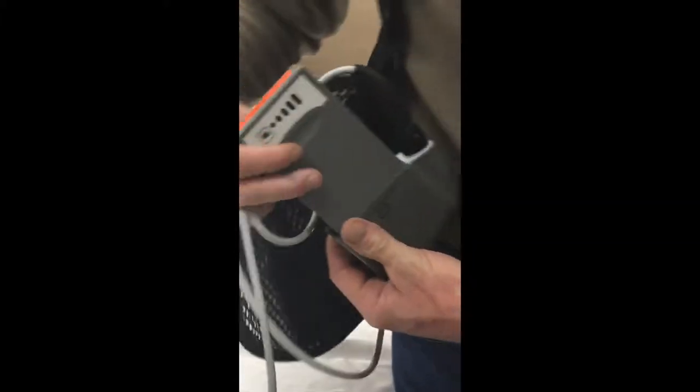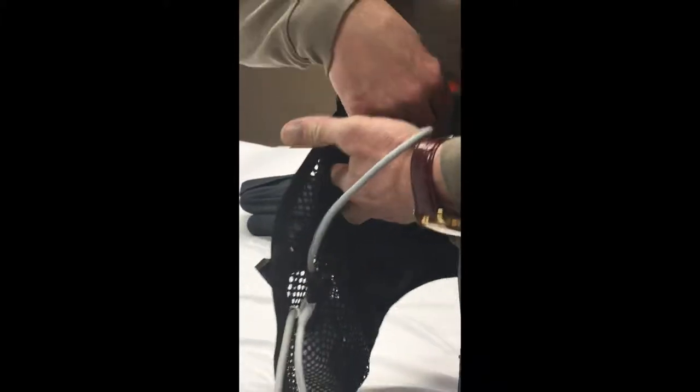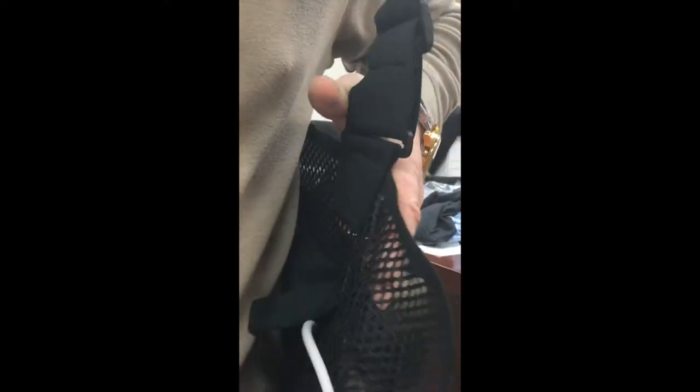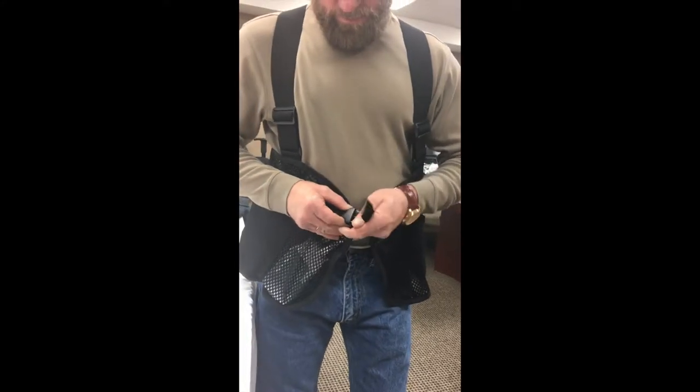The battery pockets are located just behind that, positioned directly underneath the arms to reduce the fatigue on your back. They go in like that, and then they seal shut with Velcro and buckle shut.